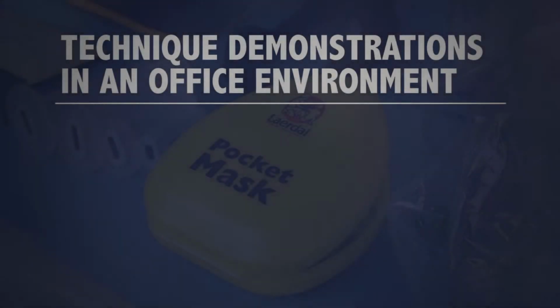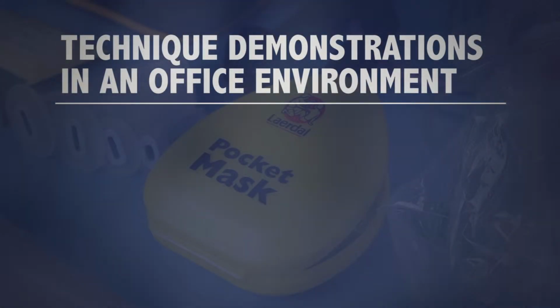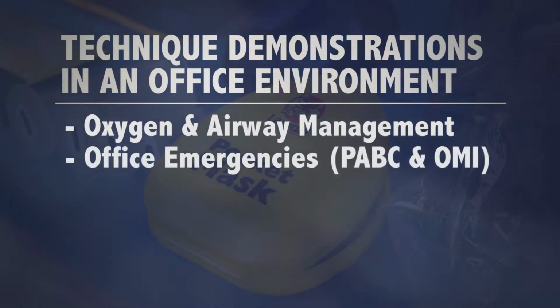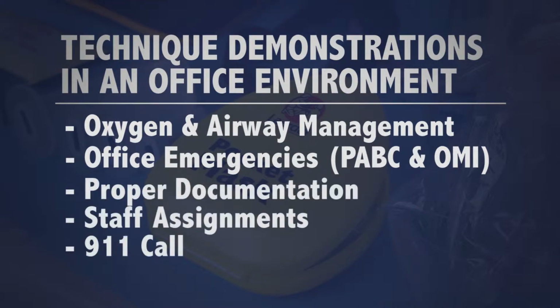In our final segment, we want to demonstrate some of the techniques that we've discussed in our earlier lecture, and we want to put it into an office environment. First, we will discuss and demonstrate the use of oxygen and airway management techniques. Then we will run through 2 office emergencies, keeping in mind our systematic plan of PABC, position, airway, breathing, circulation, and then OMI, oxygen, monitoring, and intervening. We will talk about proper documentation, staff assignments, and doing a 911 call.